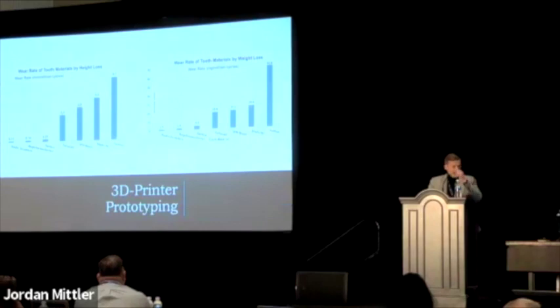All right, and this is another one that was really surprising to me. This is comparing the wear rate of milled materials on the right-hand side to printed materials on the left-hand side. And the printed materials are showing a significantly lower wear rate compared to iVotion, which is one of the most common pucks, and Shofu HC.